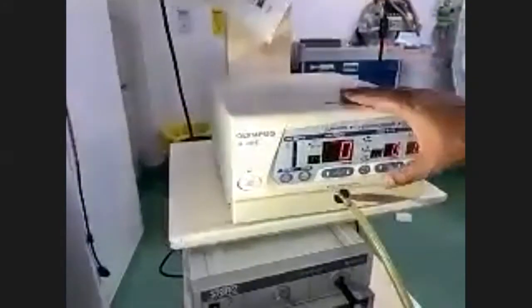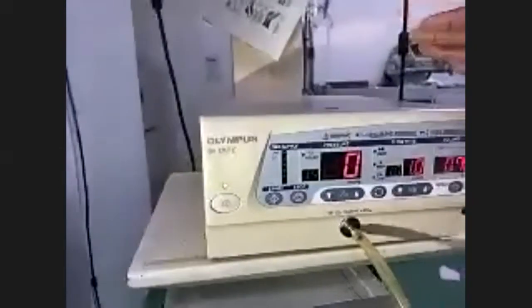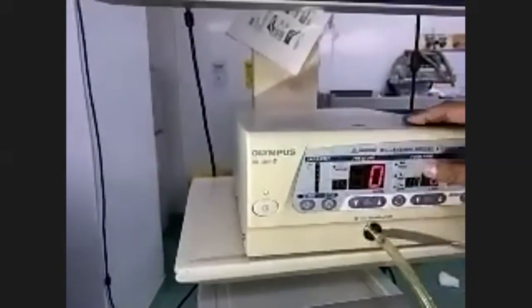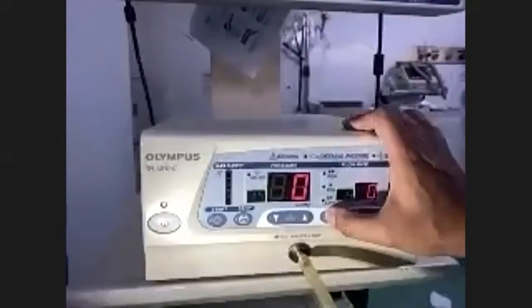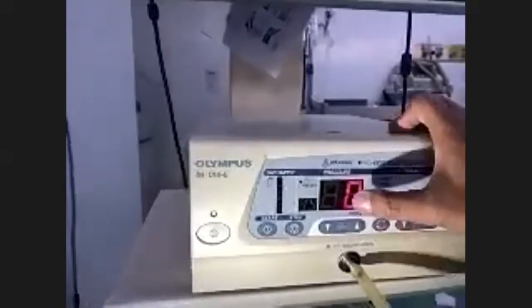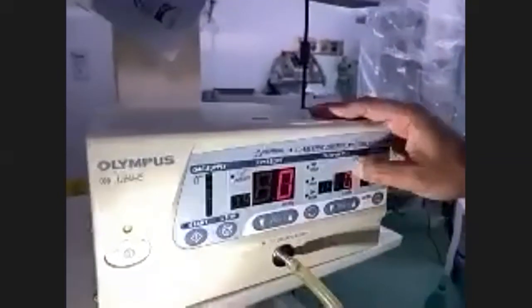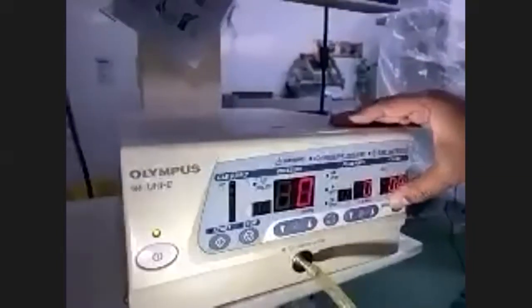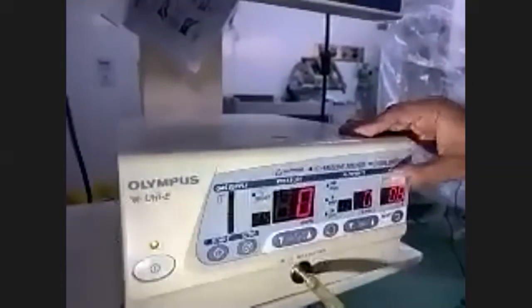The usual pressure we keep in the abdomen is 14 or 15 millimeters of mercury, which should be less than 19 to 20 millimeters of mercury. Okay, and I'm stopping it. Here you can see the flow rate. You can start with a low rate, then shift to the medium, and then to high rate. Okay, and you set the flow rate up to 14 or 15 or 16. And this is the area which will show you what the flow rate is in liters per minute, how many liters per minute is going inside the abdominal cavity, and what the volume is, which can be shown here, right?